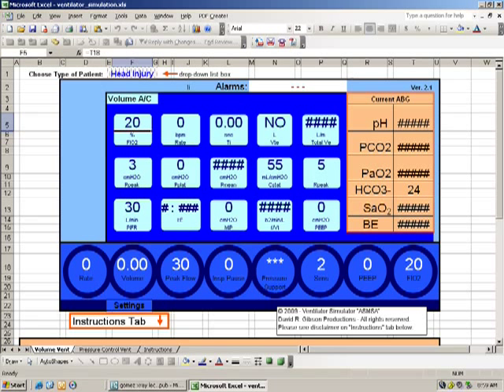Here's what the spreadsheet looks like when you download it and open it. I had a group of the Collin County students do this. There were a group of five and they got to collaborate on the settings such as the rate, tidal volume, FiO2, and PEEP. And here's what they came up with. Oh yes, and before I forget, there's a tiny drop-down box, a drop-down list box at the top. Change that from head injury to ARDS.